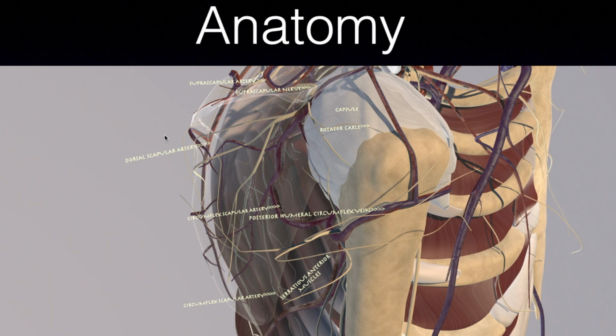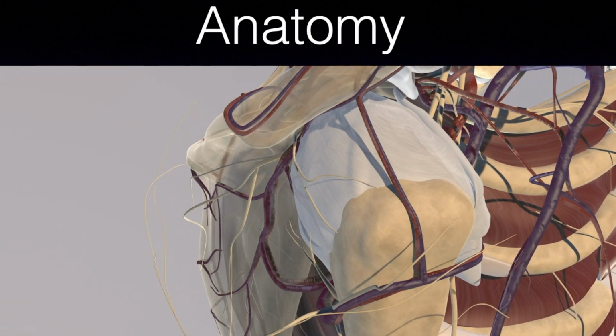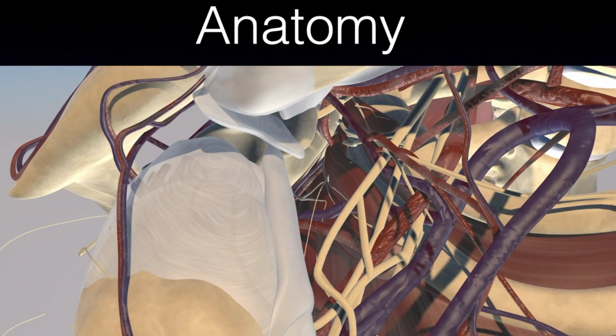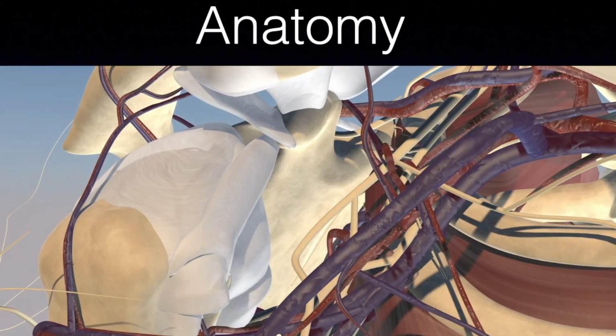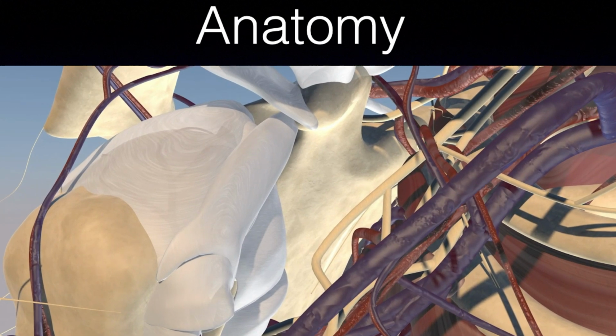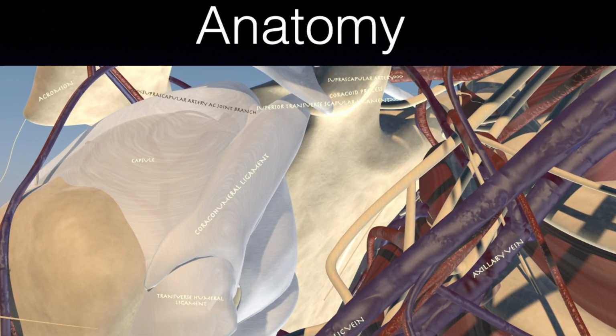So I guess one focus that I have on ultrasound is really to get your anatomy down, because if you don't really know your anatomy before you put the probe on the patient, it's not going to become clear afterwards. So always review and over-review your anatomy. And it's not such a black and white field. If you Google different sites for the anatomic structure of so-and-so, you'll find many different opinions and variations, and there is variability between people. But you'll be surprised how not black and white anatomy really is.